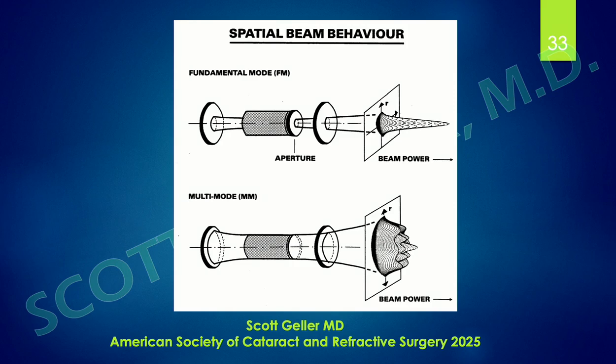The mode is the shape of the beam. And when you have an aperture that is small, the beam will have its very central shape, which is more like an ice pick than a sledgehammer.